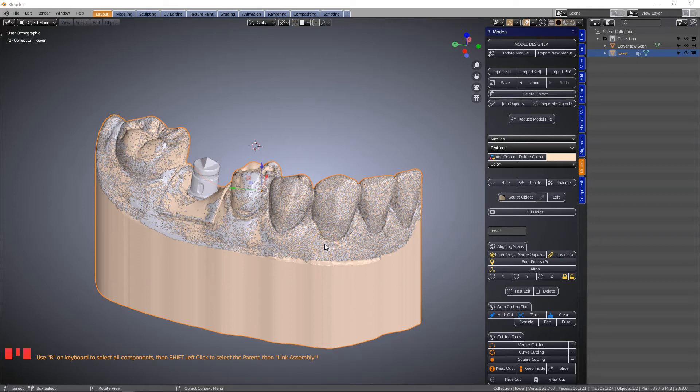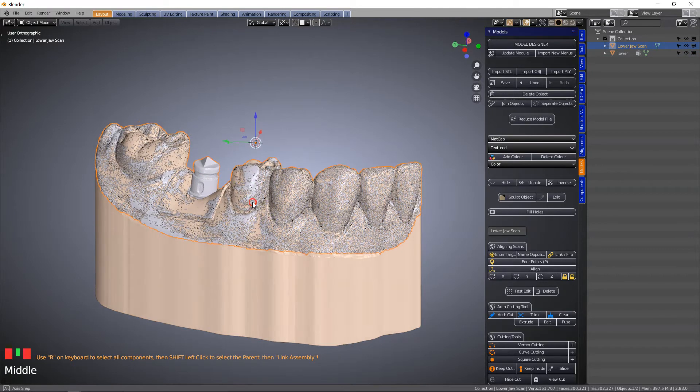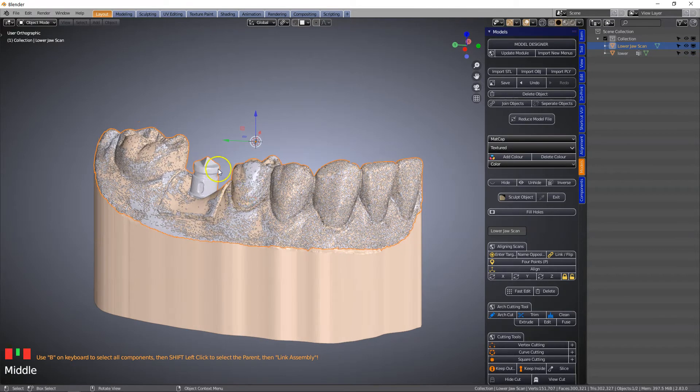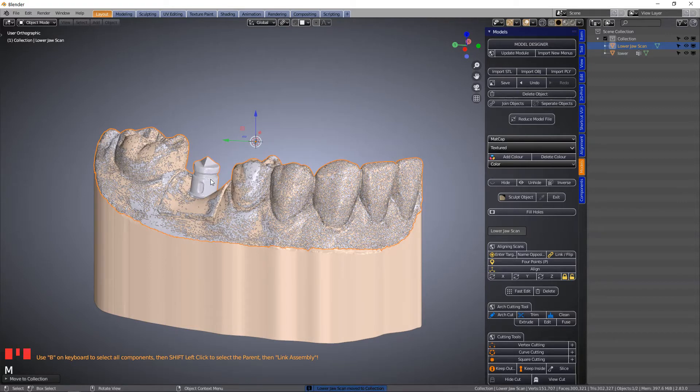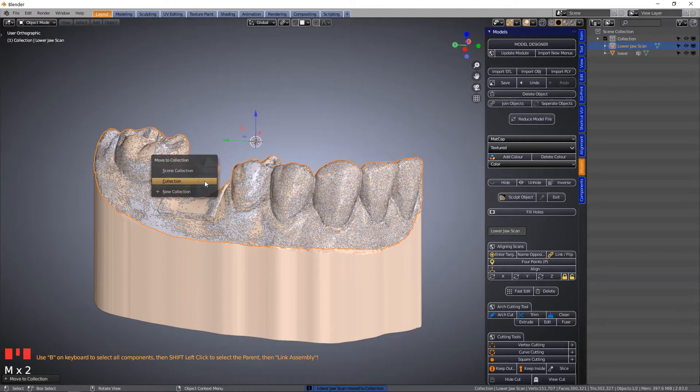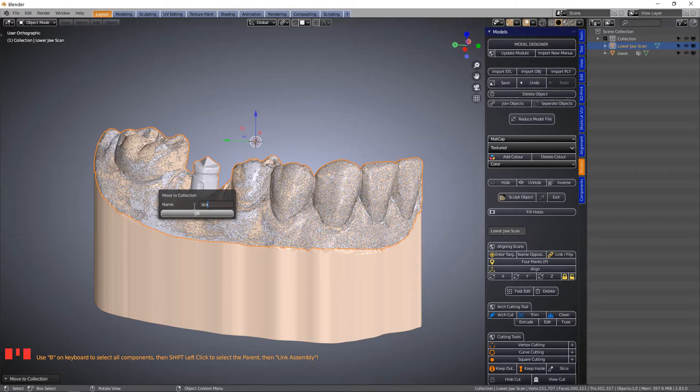In this video I'm going to be making an implant model using an Odontofix implant analog. We have a scan of the scan body in position and I'm going to move it into another layer to a new collection called scan body.